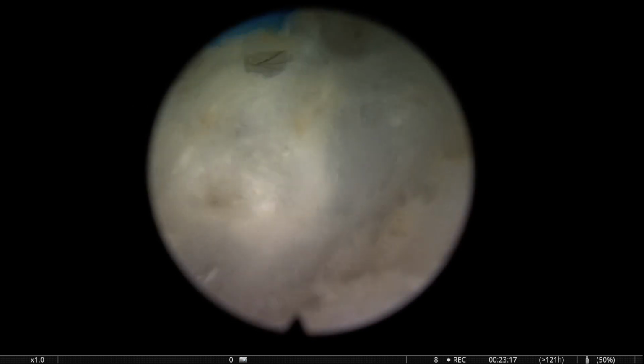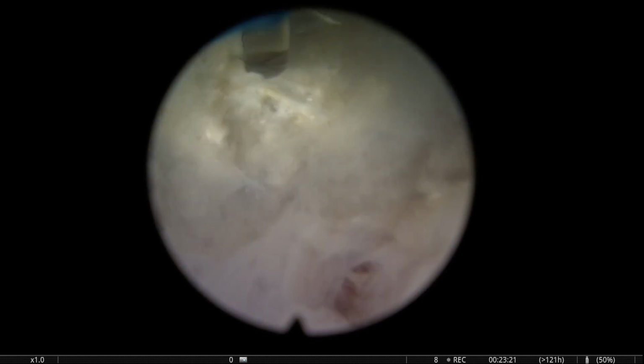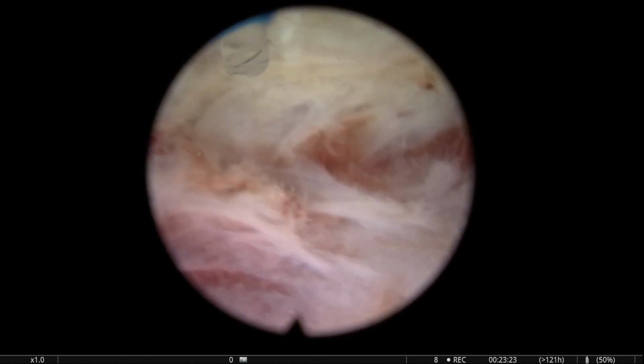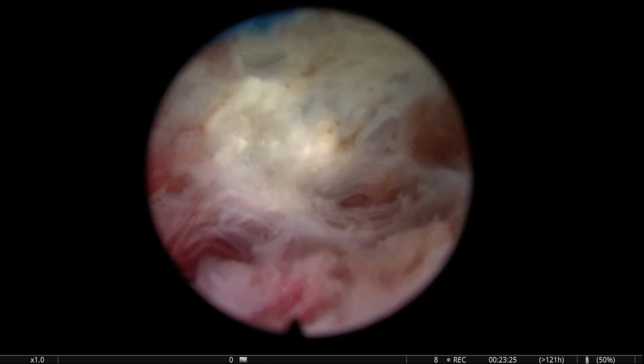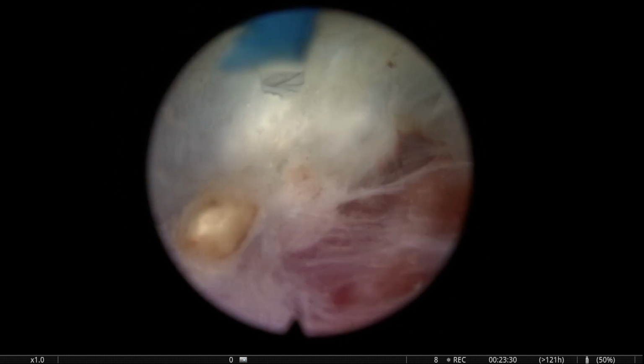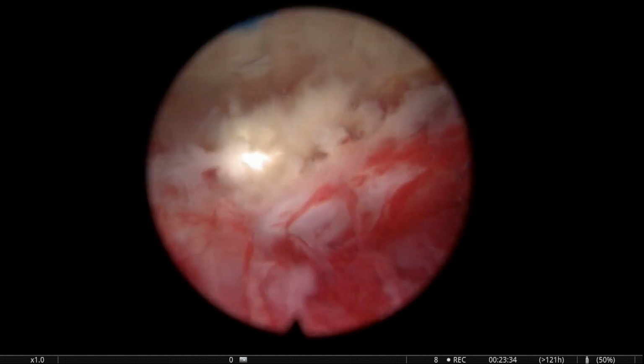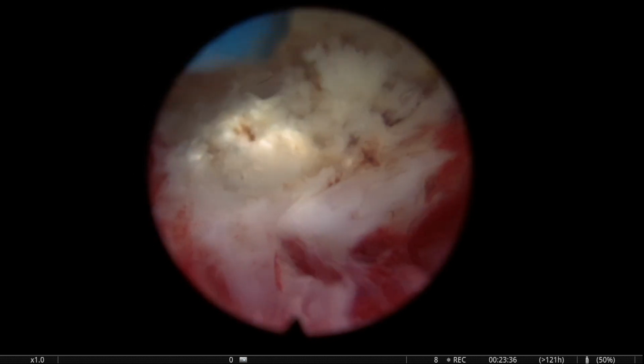If you go a little bit deeper in the capsule, if you recognize that you are starting to enter the capsule, then you have to correct, you have to fire even closer to the adenoma, so that the energy, as you can see there, usually in the posterior plane, we have to keep the energy anterior.